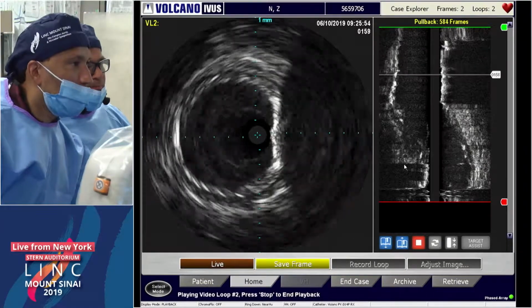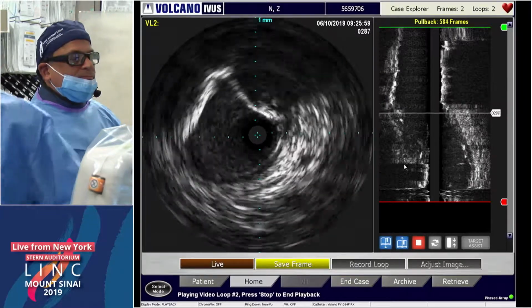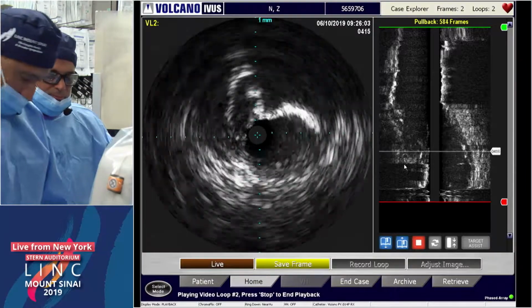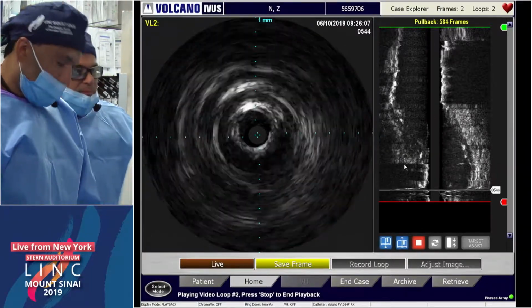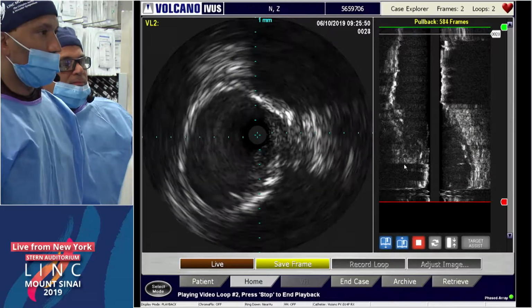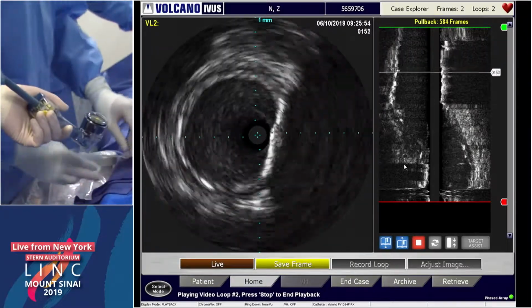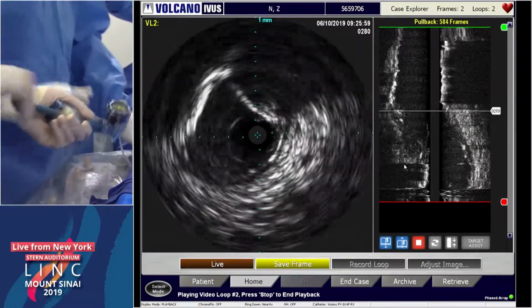I think both your angiogram and the IVUS look beautiful after atherectomy run with a 3.4 device. That angiogram looked beautiful, and on the IVUS you got a pretty good luminal gain there. We doubled our lumen. And I'm with you, quite honestly. I wouldn't put a stent here either, just so that we're balancing on the podium here. If you can get a beautiful lumen, take out the calcium, add drug to that without a dissection, I think you're doing a good thing.